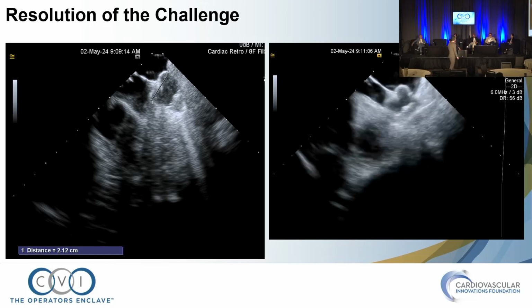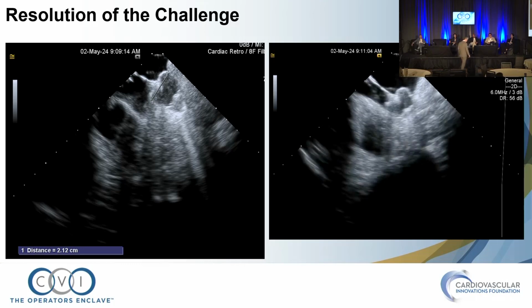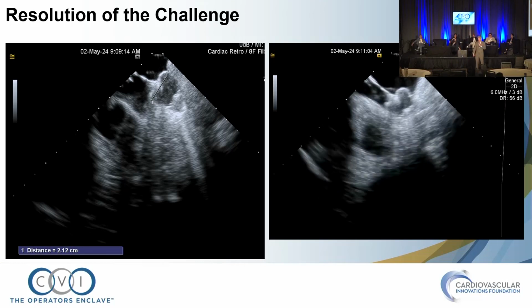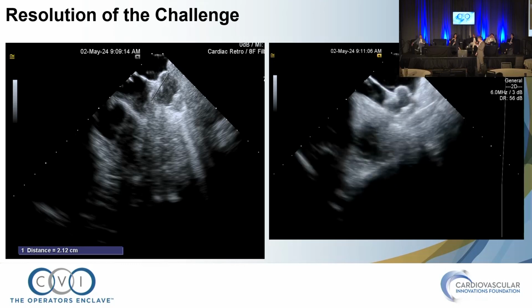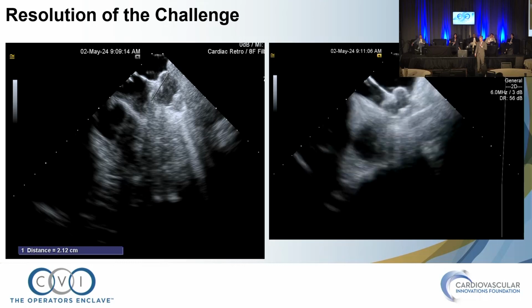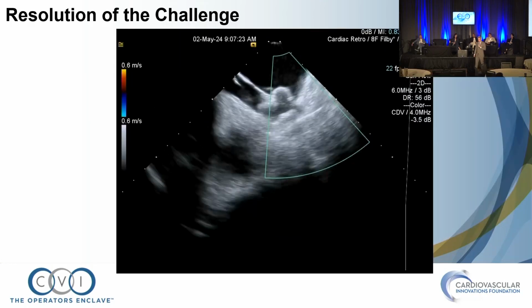Should we keep this device? This is going on to an hour case here, an hour and a half for a Watchman. We usually finish in about 20 minutes, so this is a long case for us. We could just retrieve it and call it a day.